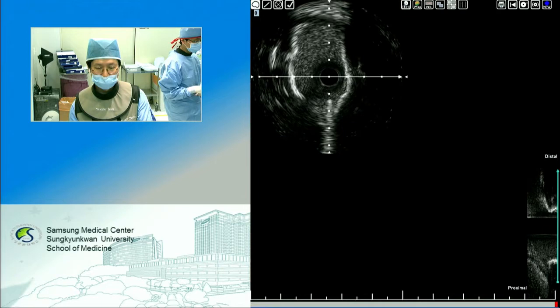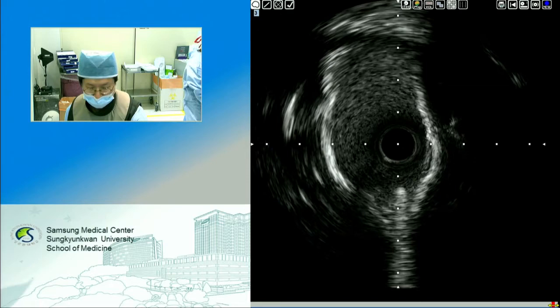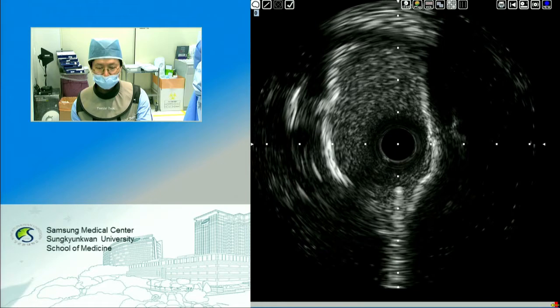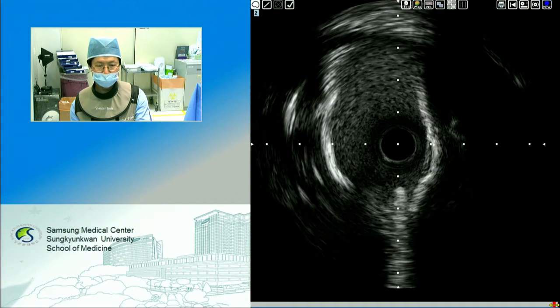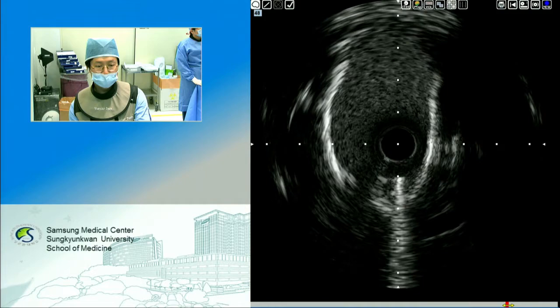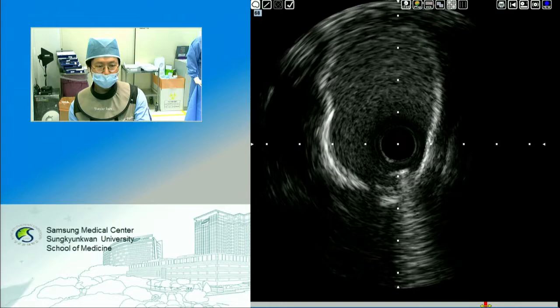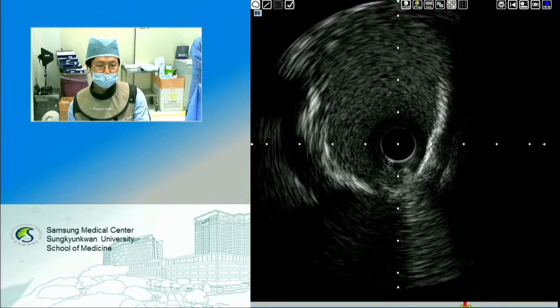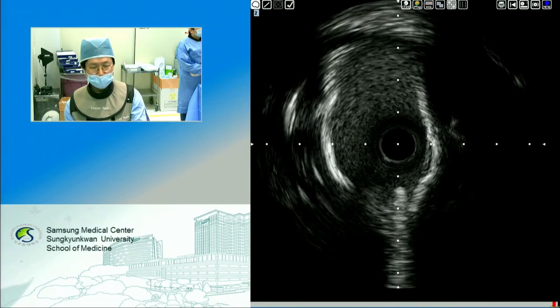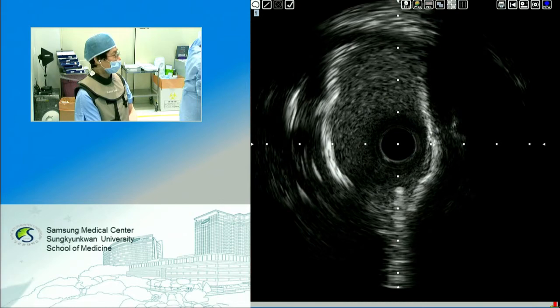The catheter couldn't enter the proximal LAD, so we just made a left main IVUS exam. The distal left main has superficial calcification. Lumen size is about 4.5 millimeters, so this is moderate to severe atherosclerosis here. And this is the mid left main. Vessel size is 5.3 millimeters. However, we could not examine the LAD because of the tight stenosis. It may be better to have an IVUS exam again after rotablator.